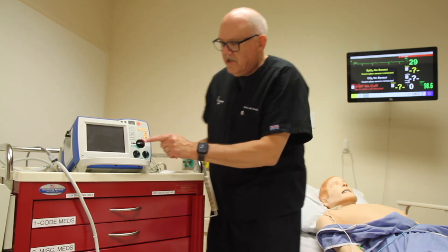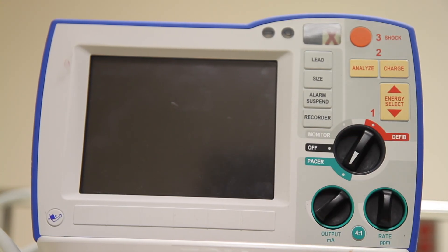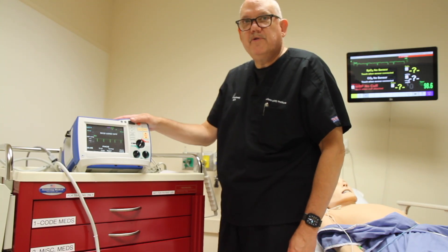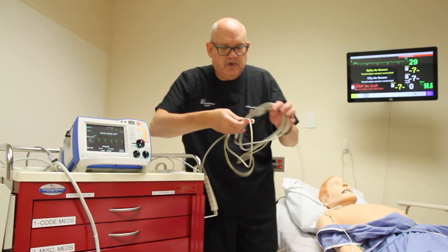Turn the monitor defibrillator into PACER mode. Confirm that you're seeing a rhythm. We are not seeing a rhythm because this particular device also needs to have input from the limb leads. We will attach the limb leads.